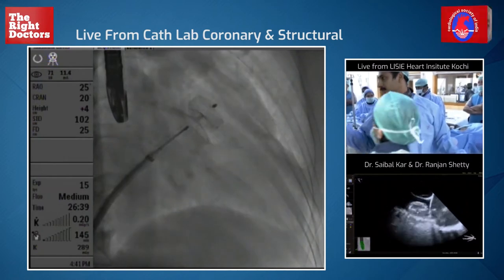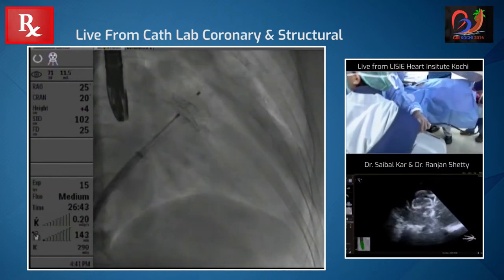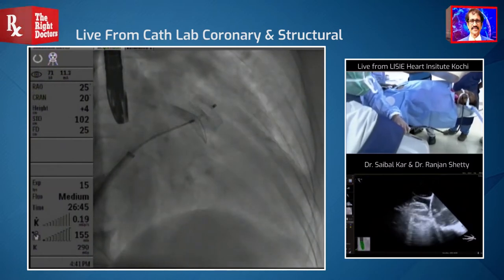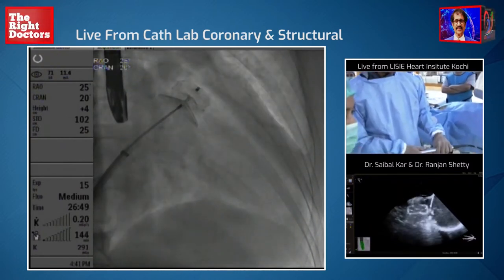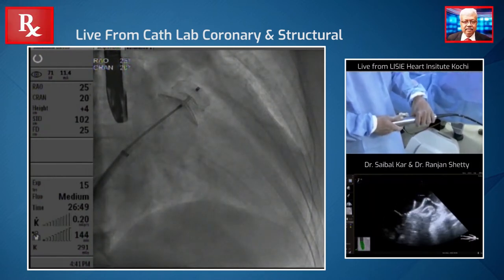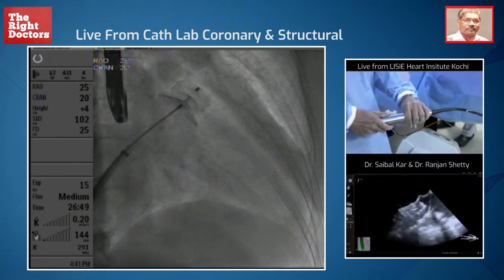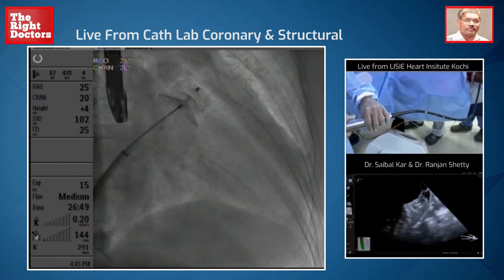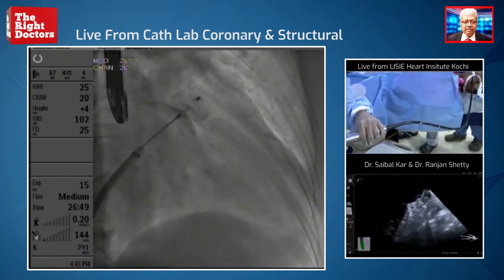Is it moving? Good — good separation. Good tug. How do you feel on echo, Dr. Edwin? Looks great. Ideally compressed. Let's look at some other views — 45 looks great, right? It looks very nice exactly where we should be. Can you show them, Edwin, how we're distal to the circumflex?